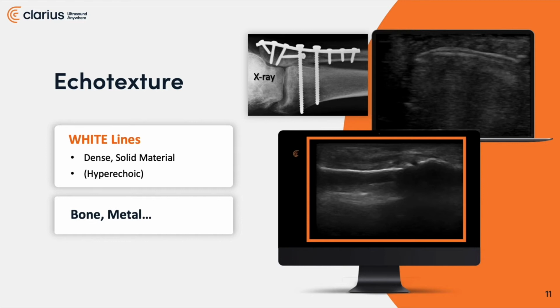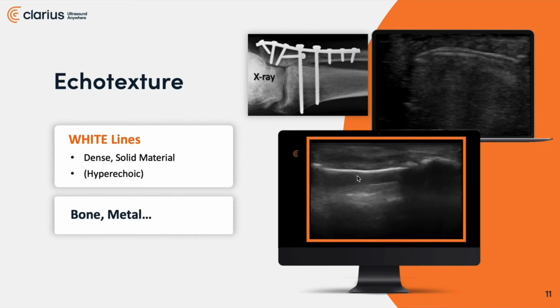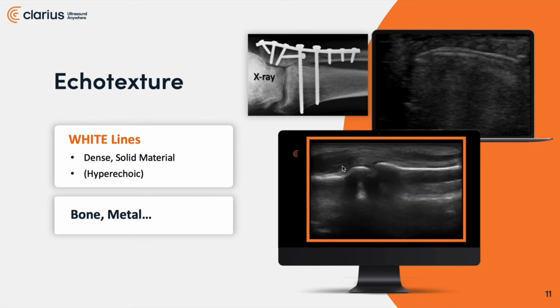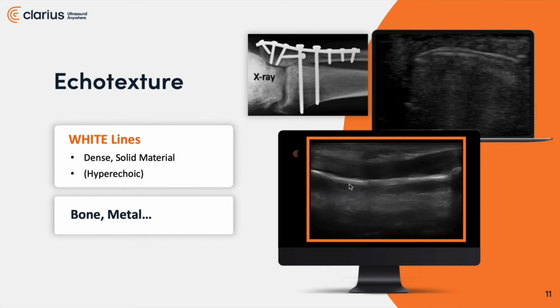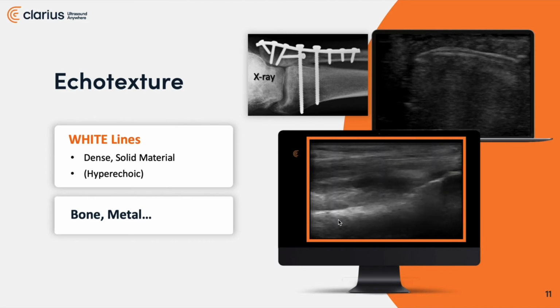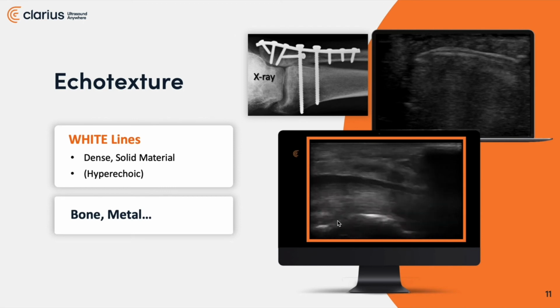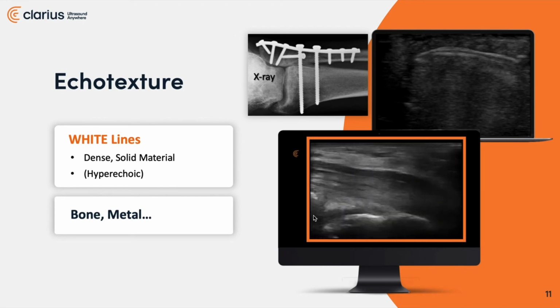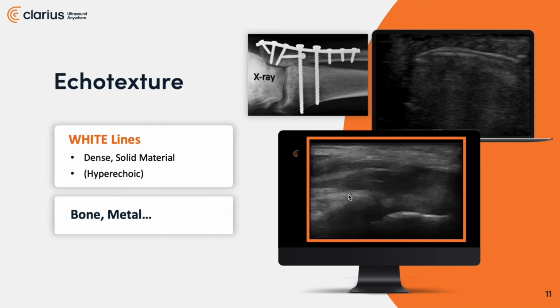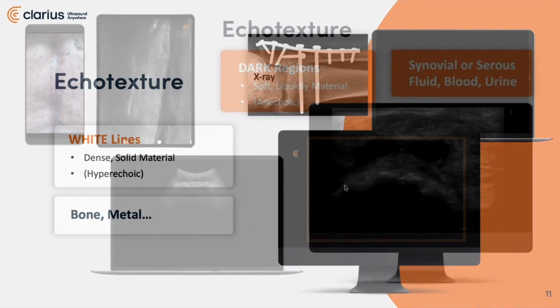So follow along with me here. We're talking distal phalanx. This is the DIP. This is the middle phalanx. This is the proximal phalanx. You can see the metacarpal head. That metacarpal head goes to the base, and we're now seeing carpal bones all the way down to where we're actually seeing the radius, the distal radius. We're able to see tendons here, but that's an aside. I want to have you take a look at bony echo signatures.